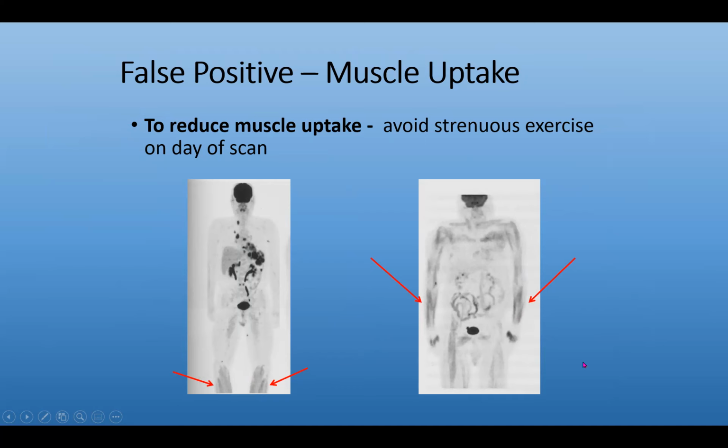So generally speaking, we want them to avoid strenuous exercise, certainly on the day of the scan. Some places are even saying the day before to not do any strenuous exercise, and certainly during the uptake period, you don't want them doing any exercise.